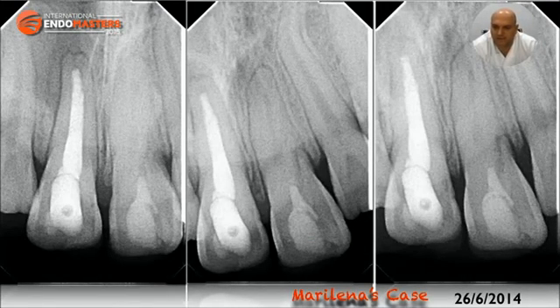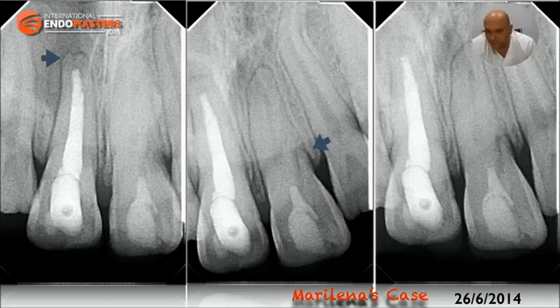Continuous root development and dentine wall thickening of the left maxillary central incisor was evident, but you can also notice continuous root development and dentine wall thickening even in the right maxillary central incisor under the MTA. Moreover, you can notice clearly here that the lateral defect, a rupture of the dental structures, seemed 4.5 years later to be completely healed.